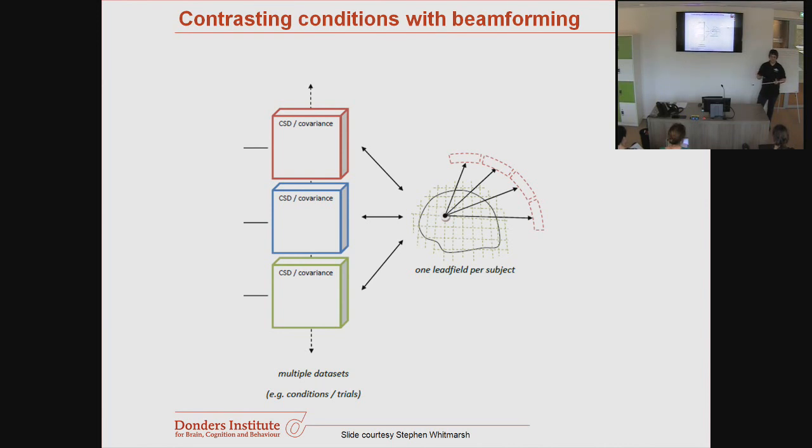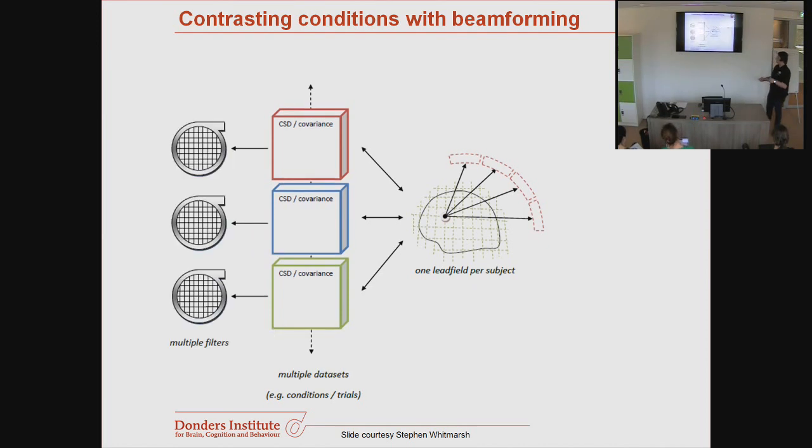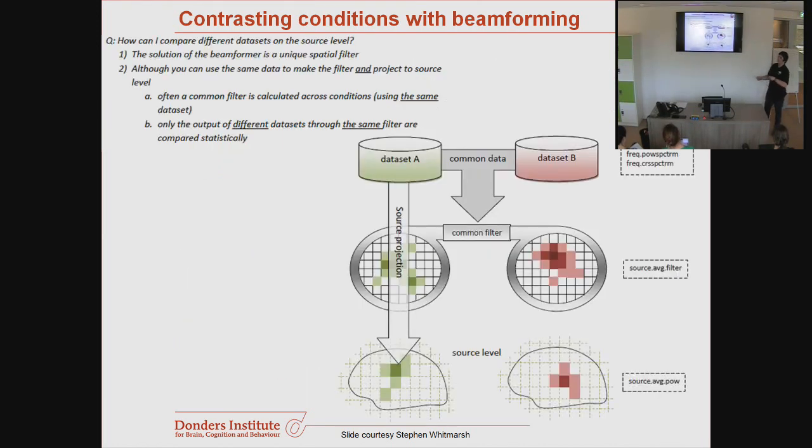You all understand this? Okay. So a solution to that is, instead of computing the W for each condition separately, you have your two conditions, you segment the data like you do, but before you compute the W, you pretend those data to be one. So you append the data again. You compute your W, what is then called a common filter, and then you separate your data again. So you multiply W transpose times your data, which is the green one, and the same W, the same filters, with the red one, and then you plot them on the brain surface or in the 3D volume.